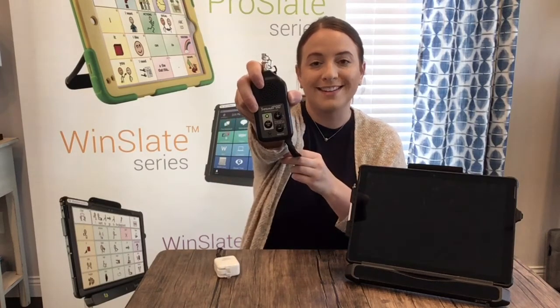Click the power on button — green light. Now we know the sound pod is on.